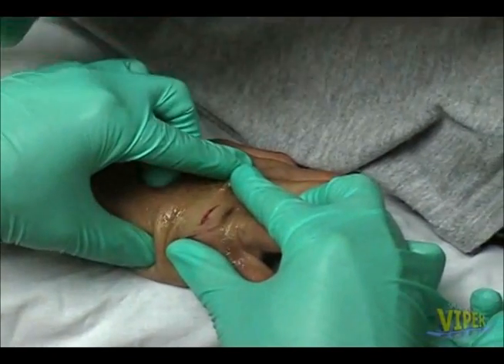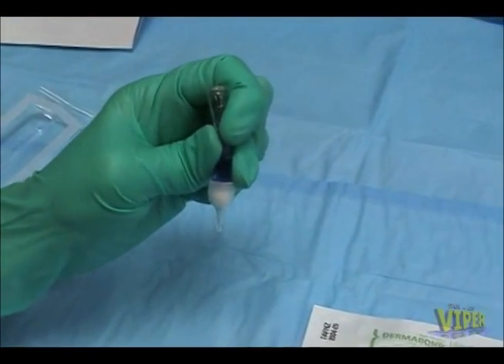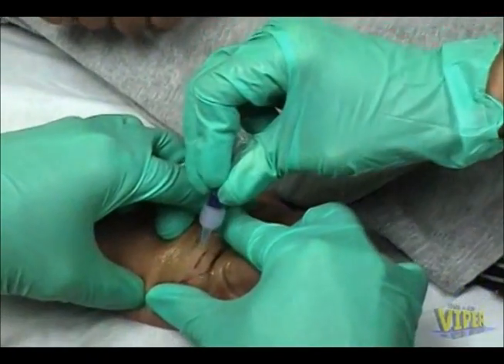An assistant is usually necessary to ensure close approximation of the wound edges, so that the tissue adhesive does not seep into the wound. This can be done by having the assistant push the wound edges together, or actually having the assistant pull the wound longitudinally from both ends of the wound.